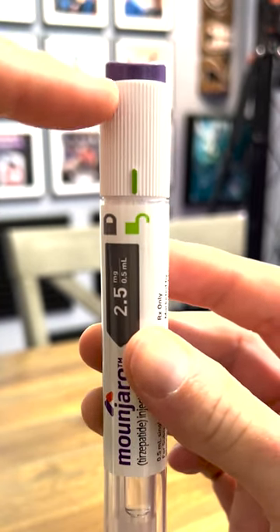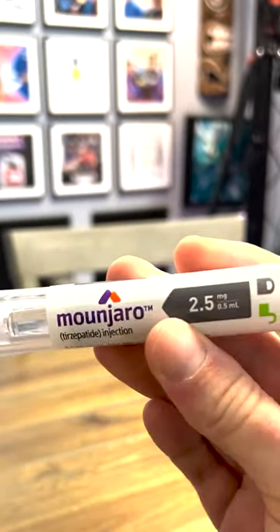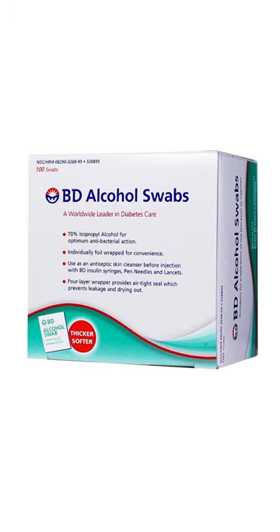Make sure you don't push the purple button until you're actually ready to do the injection, because there's no way to reset it. First thing you want to do is alcohol a small area of skin on the stomach.